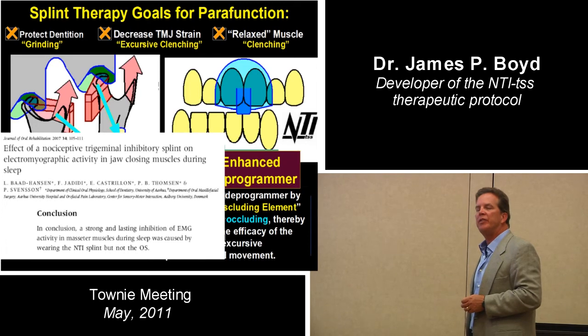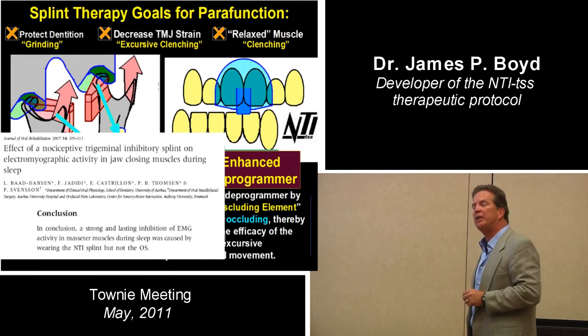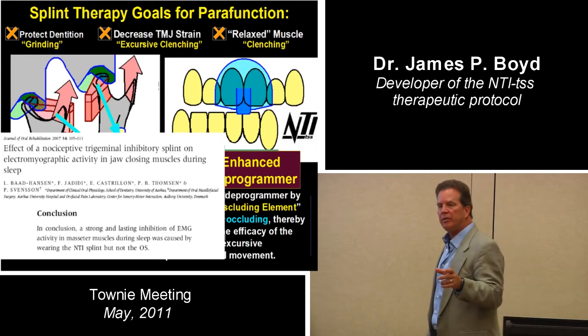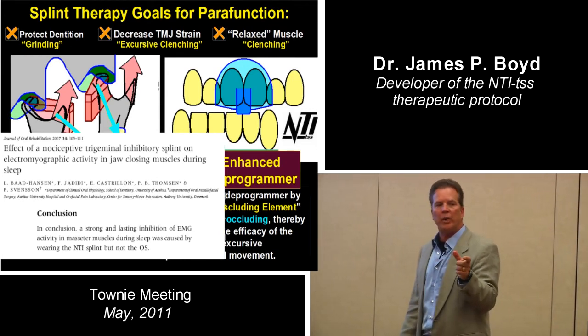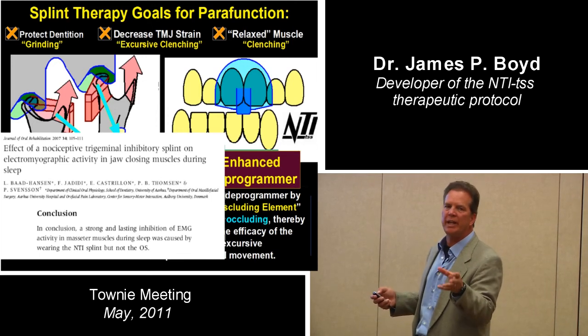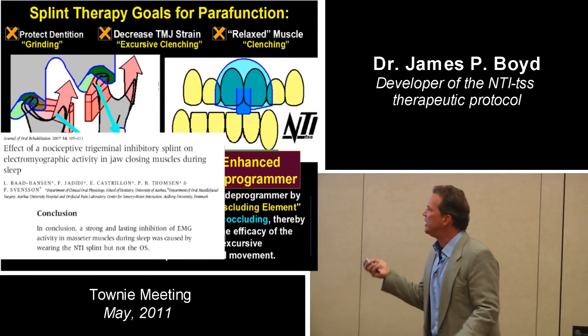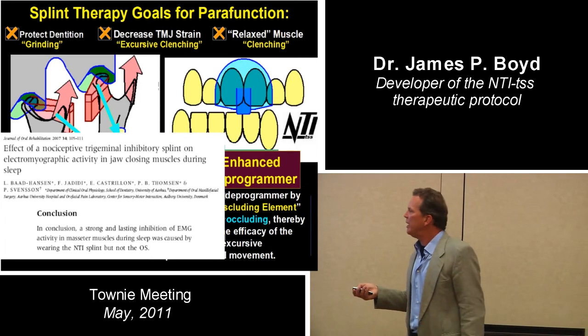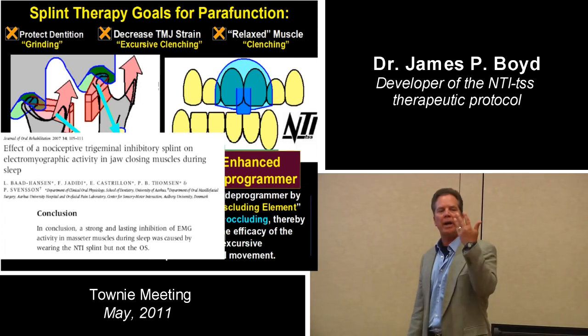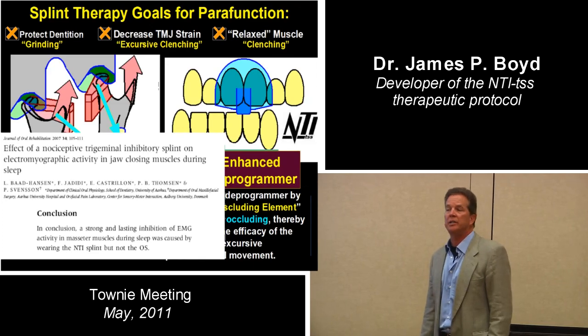Because dentistry thinks after you put the splint in, after a while the effect goes away. That's been the legend in TMD. You put in a splint, they feel fine for a week or 3, and all of a sudden they don't feel fine anymore. They habituate to the splint and they get after it. So these authors are like, isn't that weird that it's a long-lasting inhibition? They don't get used to it and go back up to their 70 or 80% because it's not possible.